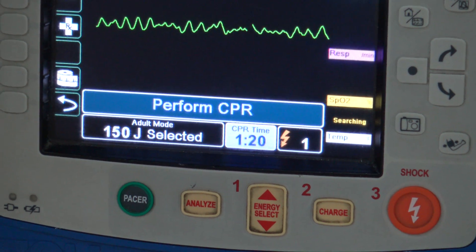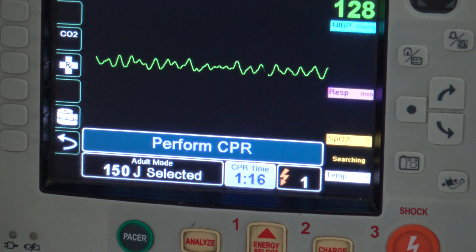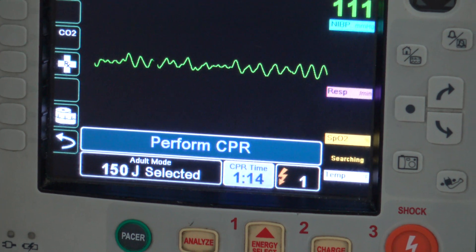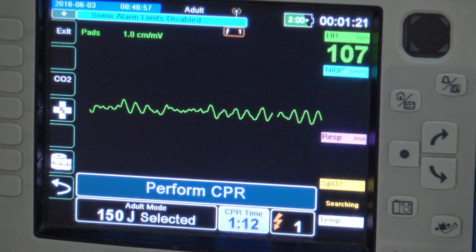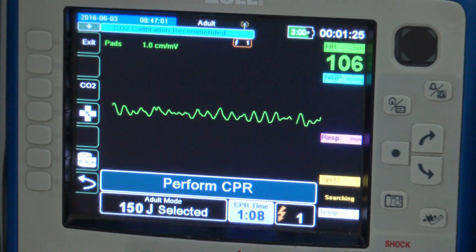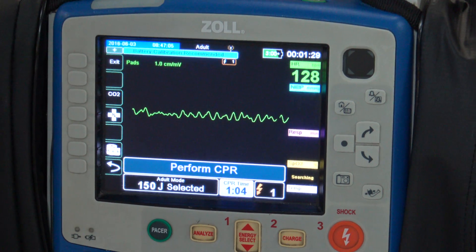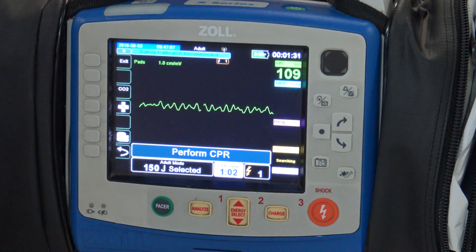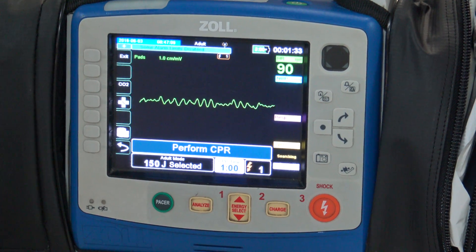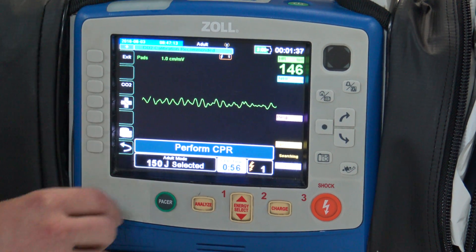Two minutes on the chest and then we're going to be prompted to analyze rhythm again, at which point we will switch compressors so that we minimize our interruptions to less than 10 seconds. Some other things you'll notice is that it's going to count the number of shocks that we've given, which is also good to keep up with for reporting purposes.